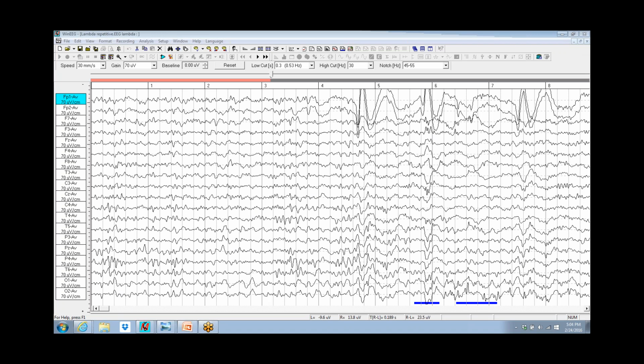So we're going to be talking about the EEG, which is the summation of the excitatory presynaptic and postsynaptic potentials, not the action potentials of the discharges in the brain, but the excitatory pre and postsynaptic potentials, the slow gradations. And when they're all added up, they make oscillations.